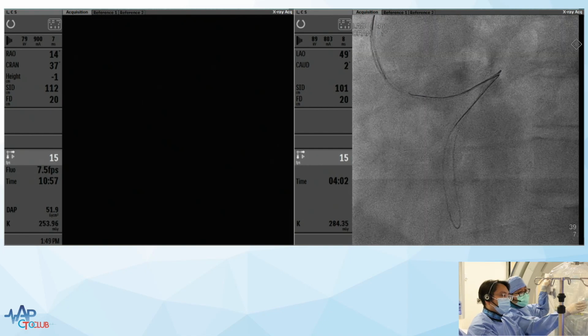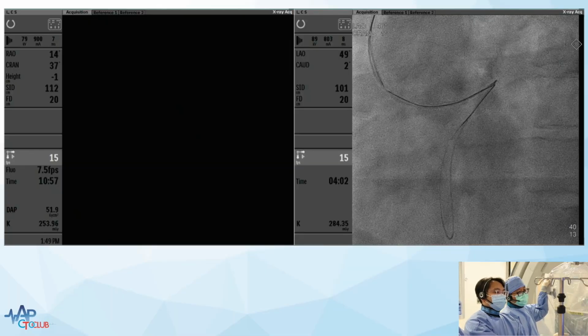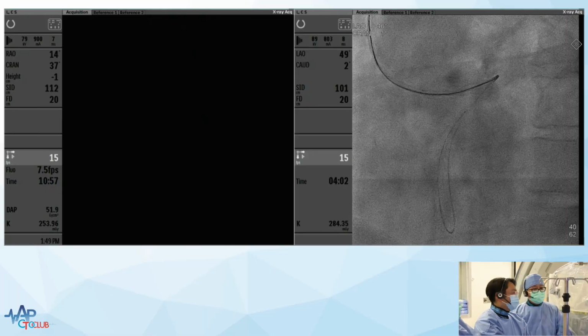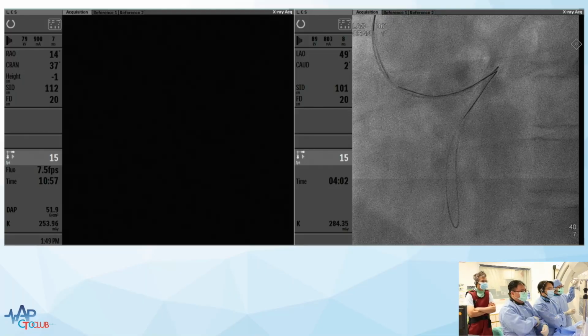You can see that right at the turn. And then I try to wire the cross-septal tip. You can see that it just tips in. It just goes in. Everything very easy for Karl today, huh? Yeah, I mean, not fair. I mean, it's quite smooth. It's very right now expert.